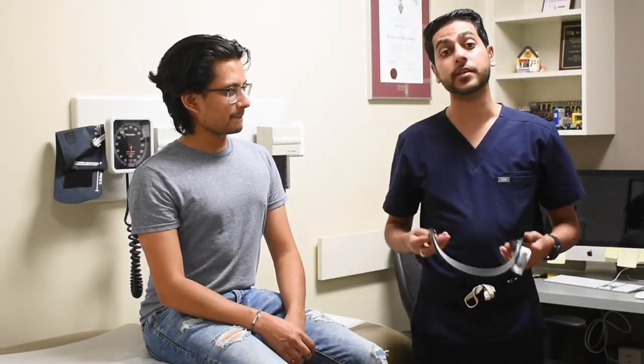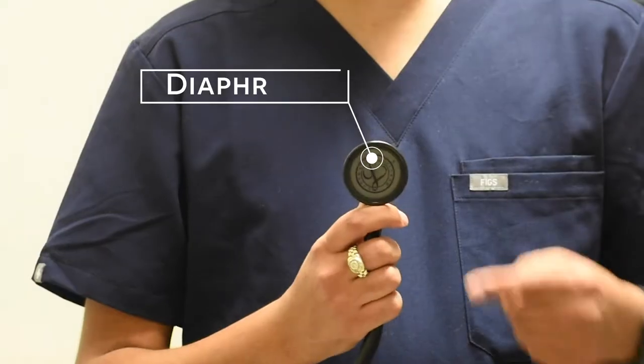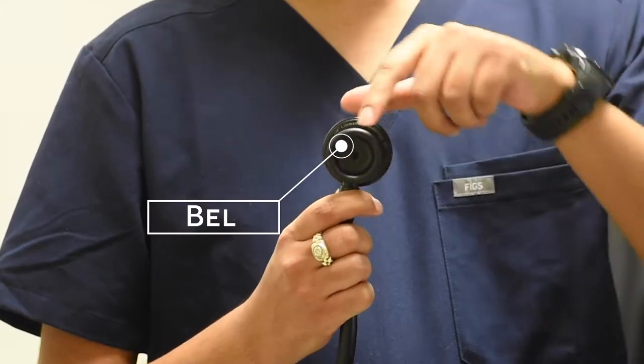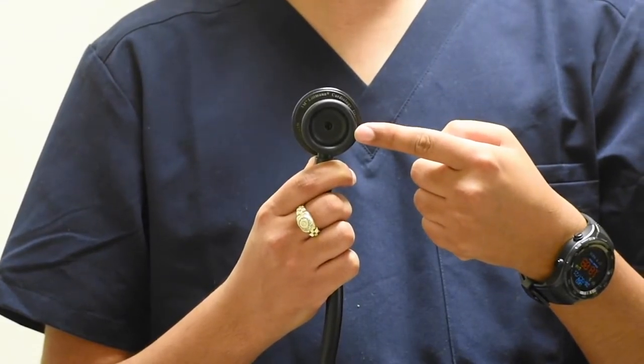There are two ways that you can listen with your stethoscope. The first being with your diaphragm and the second being with your bell. Using the diaphragm, you're able to hear higher frequency sounds, listening to things like heart sounds and lung sounds. Using the bell, we're able to listen to lower frequency sounds, helping us hear things like murmurs and bowel sounds.